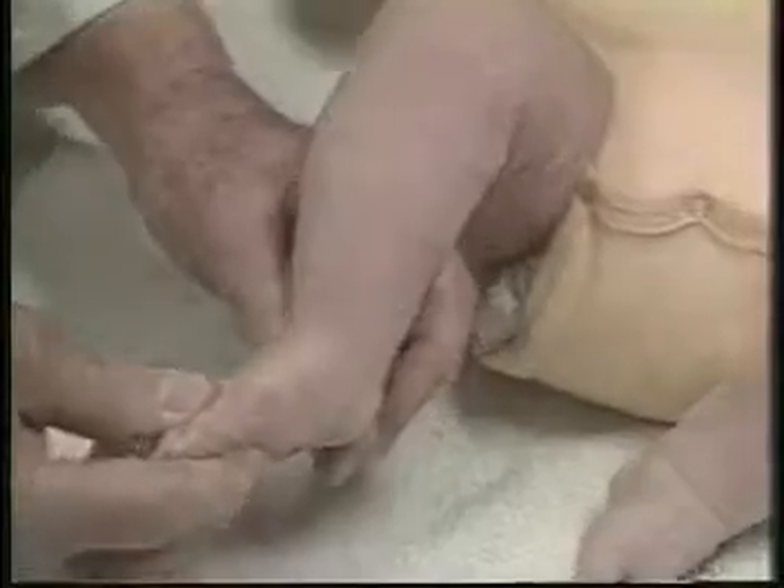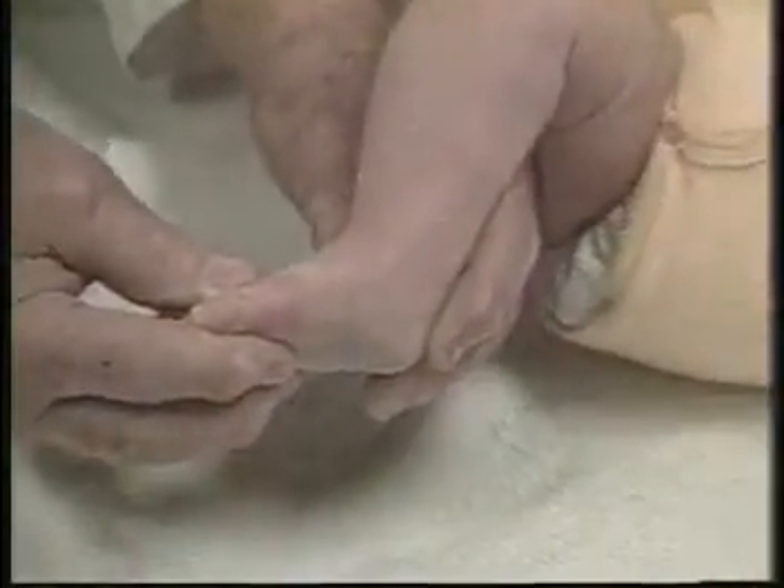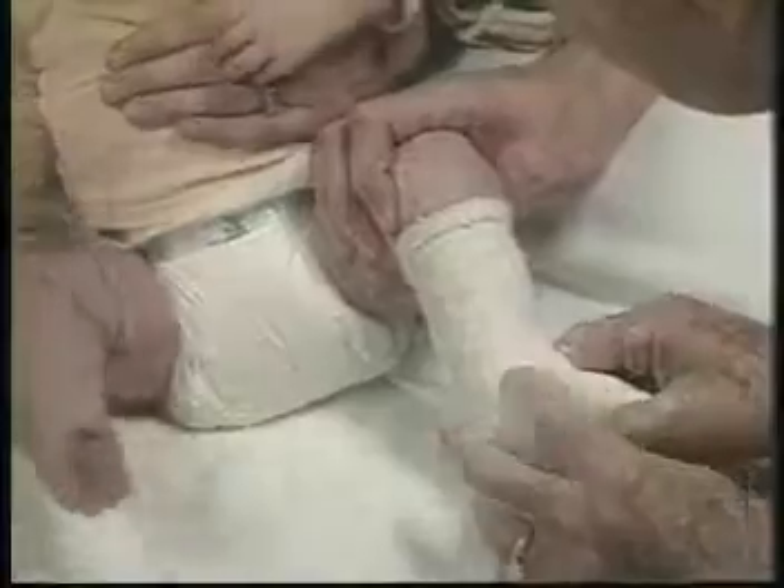When the second casts are removed, we see the feet improved. The feet are manipulated again. The forefoot is abducted in some supination, while counter pressure is applied on the head of the talos. The third plaster cast is applied while the foot is abducted, with the forefoot in some supination. The baby goes to sleep while the plaster sets. The feet are held in some supination.